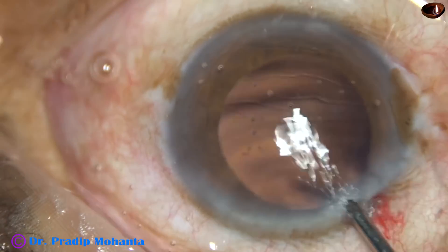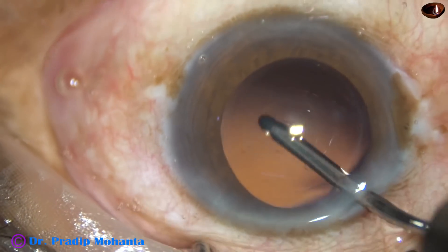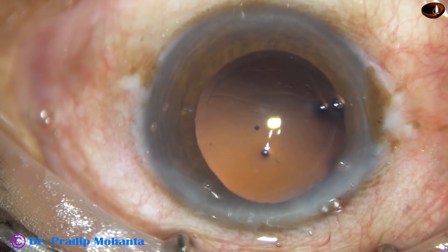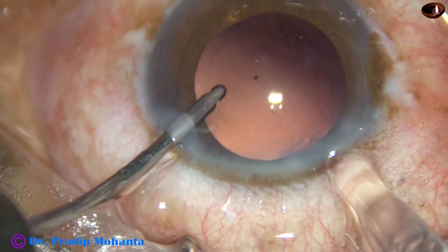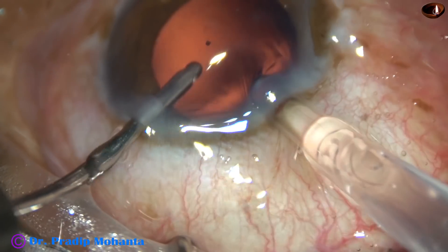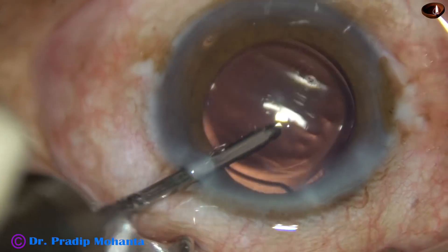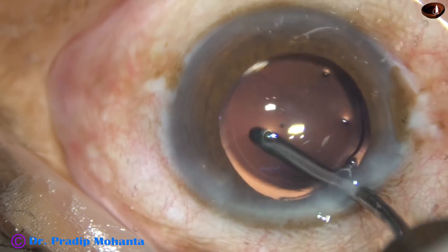This is hydro-polish — the posterior capsule is polished by irrigating fluid. And now the anterior chamber is kept formed by the irrigating fluid, and the intraocular lens is injected into the capsular bag. Here it goes — just by a gentle push of the left-hand instrument, the lens goes into the capsular bag.